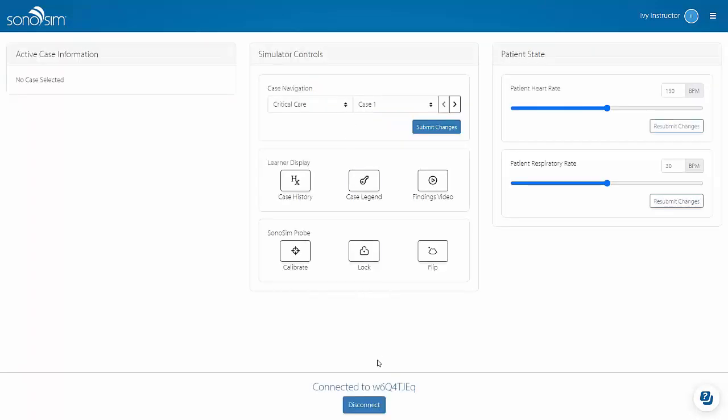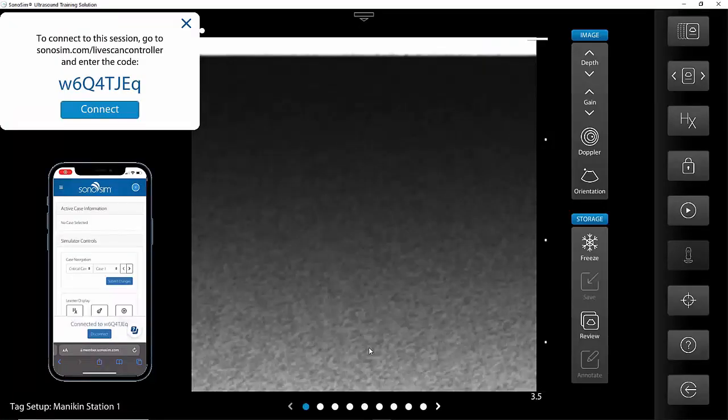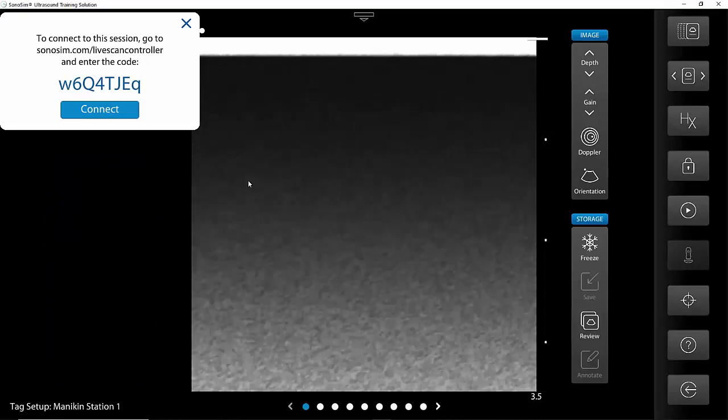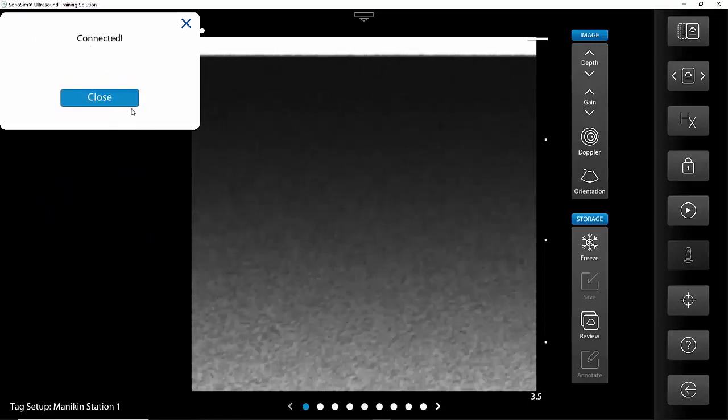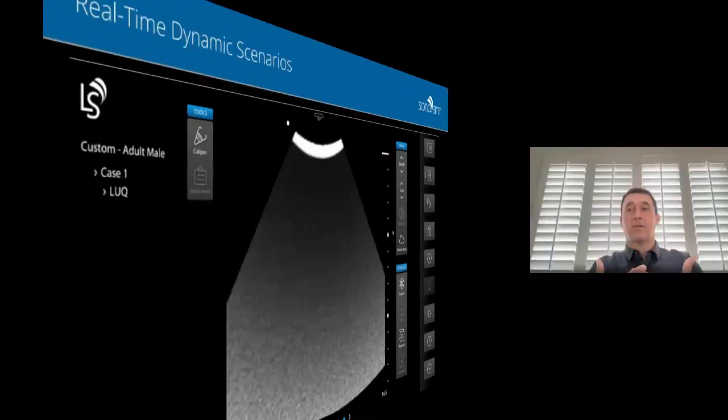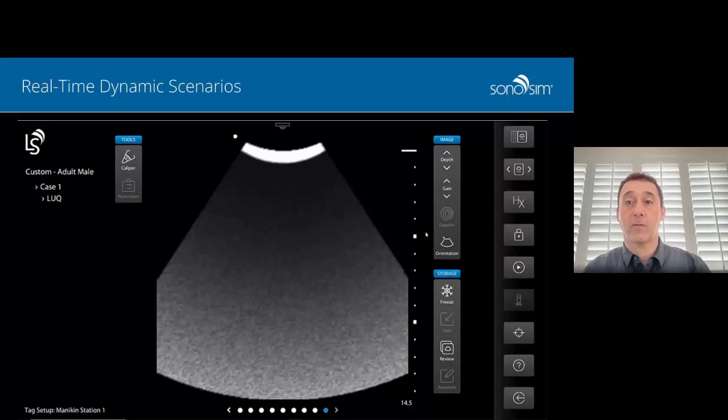And this could be at the patient's bedside, at the foot of the bed, in an entirely different room. You can take active control of that interface, and you can change vital signs, advance screens, and change different elements of the user interface. So it's a super powerful tool that allows you to control things from the foot of the bed, head of the bed, or from a different room. And once again, it's web enabled, so there are no real Bluetooth proximity requirements. So very, very excited about this, allowing instructors and administrators to really control and help learners engage in a very realistic scenario.